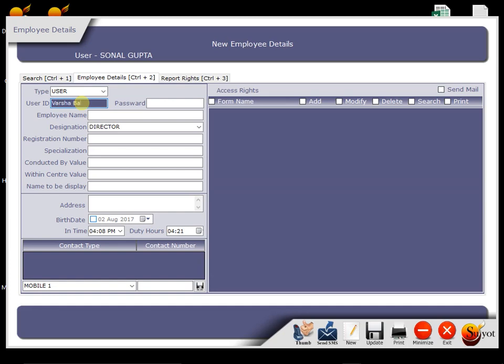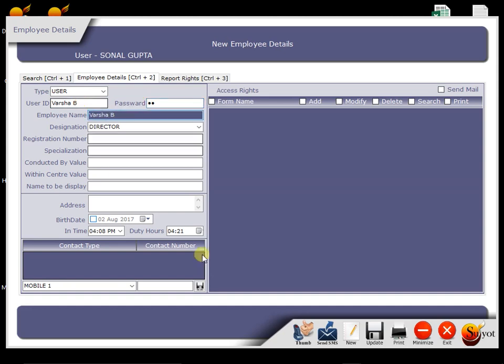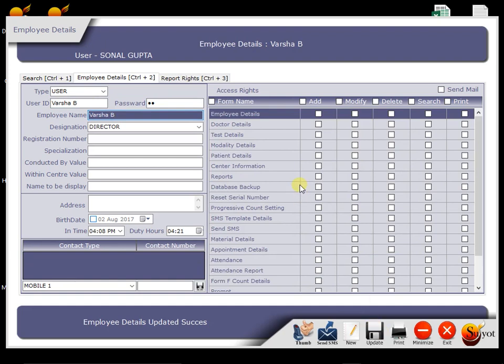Now consider for an example, here I am doing entry of one staff in the software like this. Now suppose this is your receptionist. Now what is the benefit of this menu? At the right hand side of this staff, we are having all menus and in front of it, all access rights.